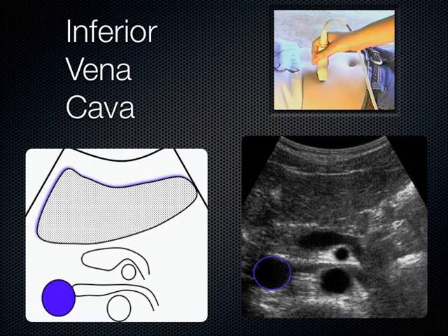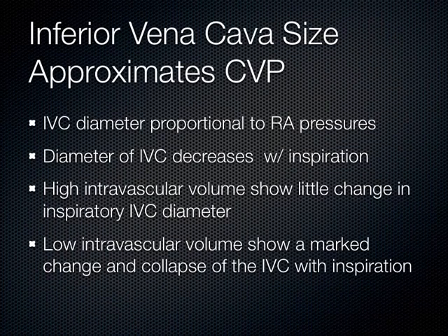Okay. One more time with the anatomy then. What's this? Good. What's this? What's this? What's crawling over the SMA? Splenic vein, very good. What's this tissue out here? Pancreas. Liver. And what's getting nut cracked here? Left renal vein dumping into the IVC. Very good. Okay. Cool? Now let's talk more about the IVC. This is something that's really, really cool. I'm jumping ahead a little bit to some physiology here without getting too deep into it.